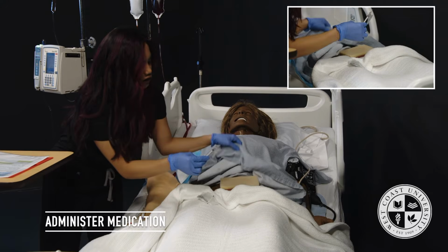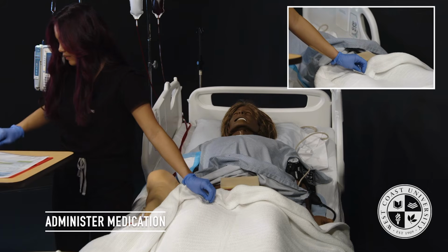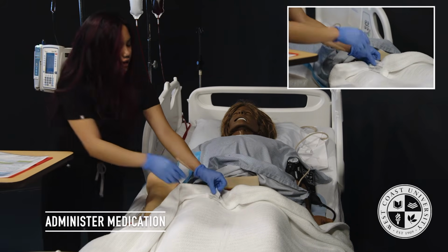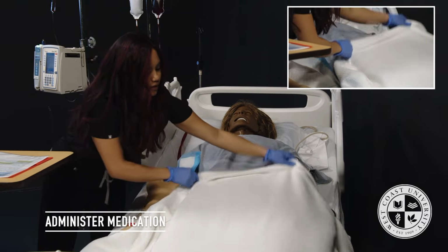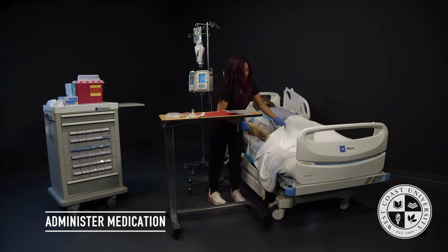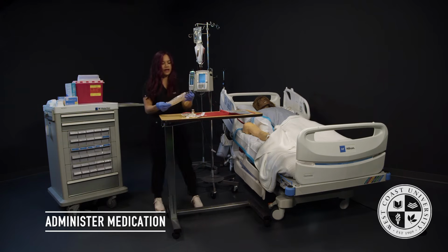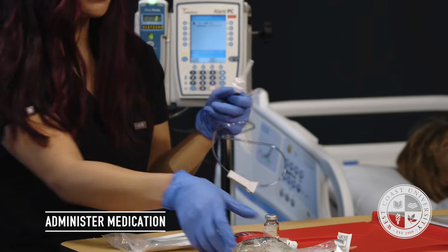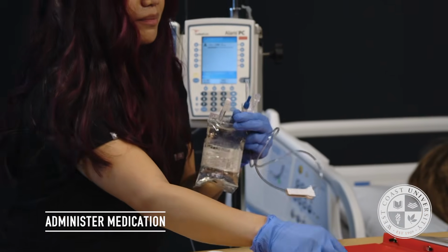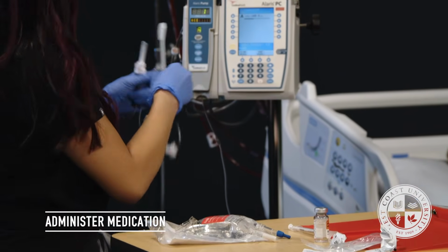I'm going to lift my injection up. I'm going to make sure my patient's not bleeding. Activate my safety lock, and I will dispose that at the end. Cover you up. All right, and now I'm going to be giving your IV piggyback medication. And so I have looked up into my drug guide book, and this medication is going to be infusing in 15 minutes. So I'm going to make sure I program my pump that way. Okay, so I'm going to go ahead and pause my pump.